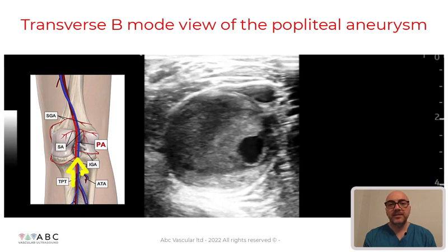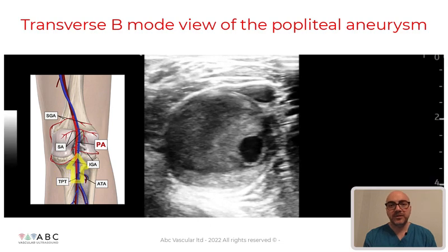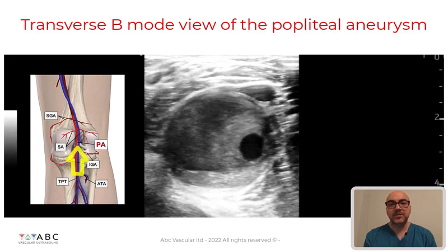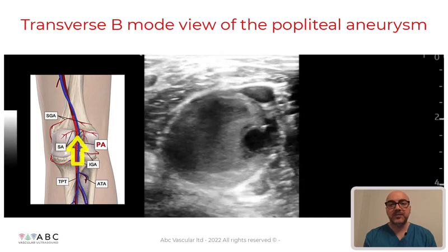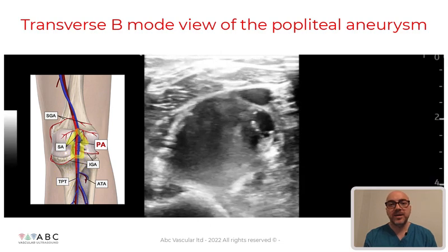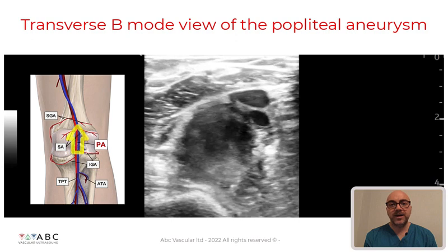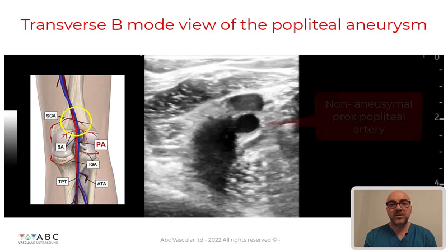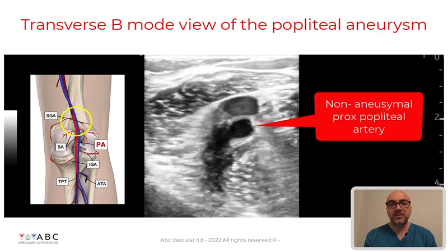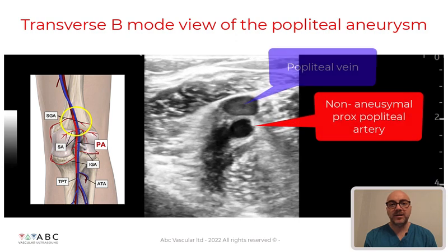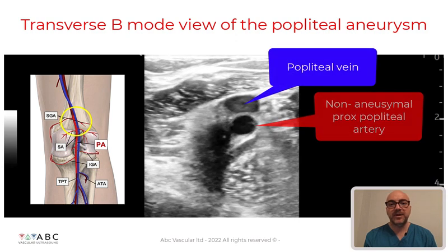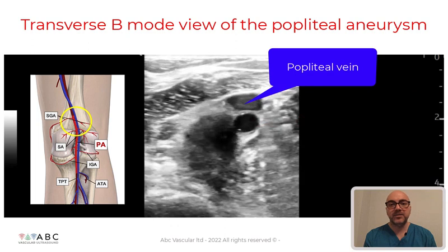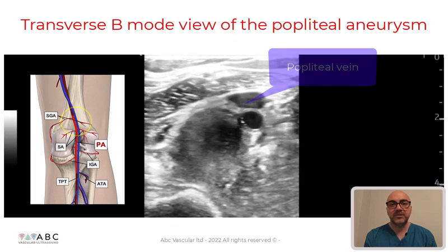By sliding the transducer upwards towards the popliteal fossa we can identify the proximal segment of the non-aneurysmal popliteal artery and popliteal vein, which lies superiorly to the artery.